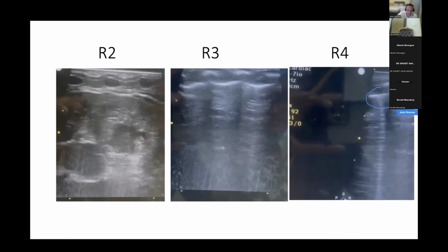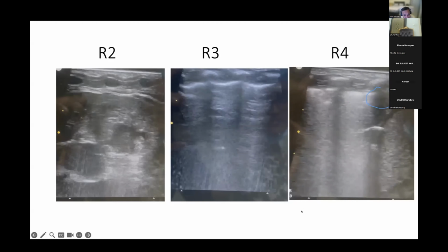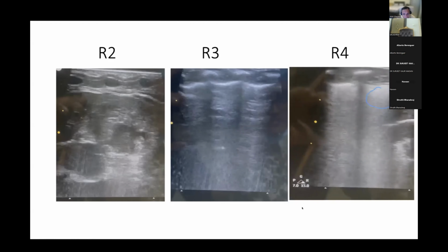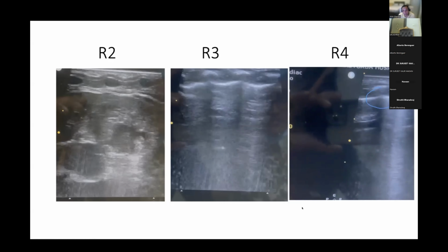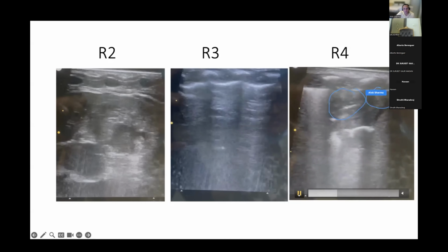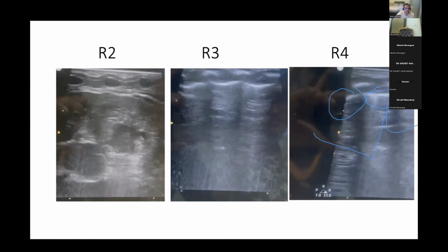And this is really important. This baby is very tachypneic, is my impression. Is that the case? Yeah, somewhere between 6 and 7. Which is why you've got a lot of pathology that's visible in one slide. I do worry that there might be a fractal sign in this region, but this is classically a very large lobar atelectasis at the bottom.